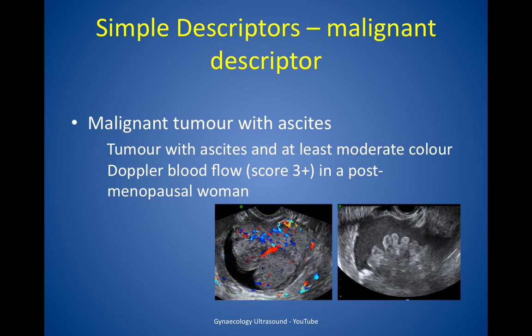This simple descriptor is a malignant descriptor: a malignant tumour with ascites where you can see a tumour with ascites and at least moderate colour blood flow — a score of 3 or 4 — in a post-menopausal woman. On the left you can see an irregular solid lesion with strong blood flow, and on the right extensive ascites.